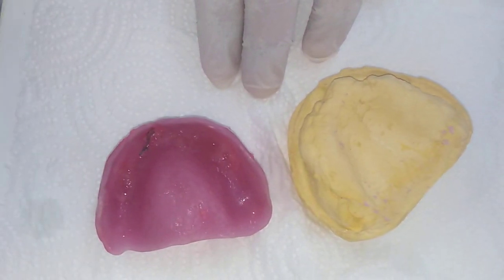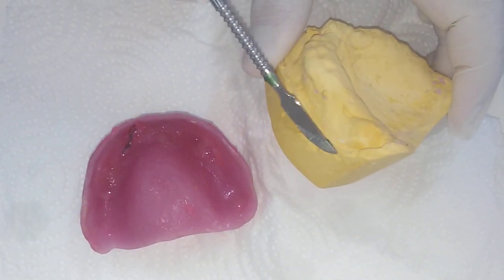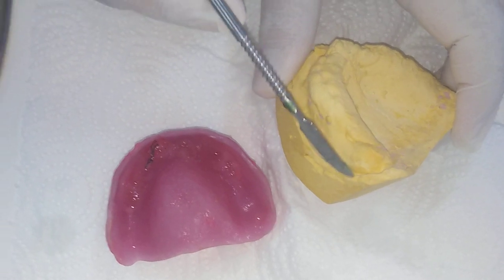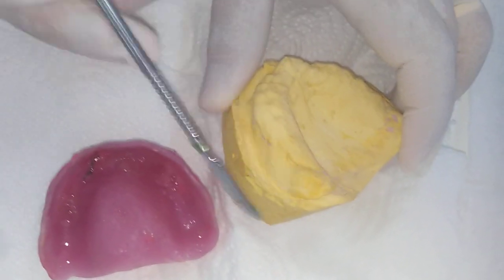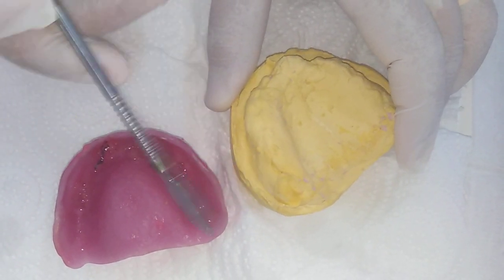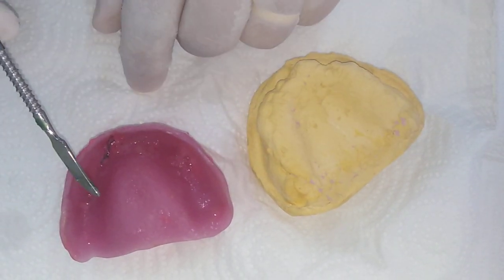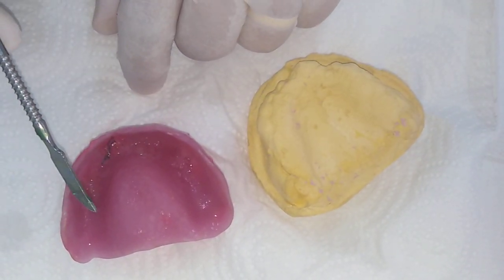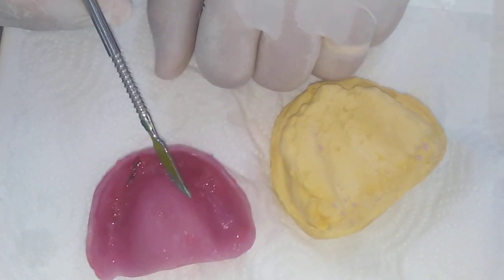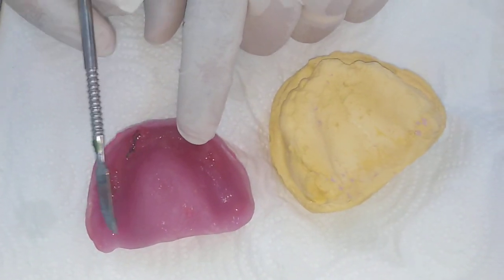Sometimes there are interferences with the coronoid. Because blocking the undercuts makes the technician place the base plate more buccally, the coronoid ends up reducing retention whenever it hits the base plate. All of these are reasons why base plates are not retentive in the patient's mouth.